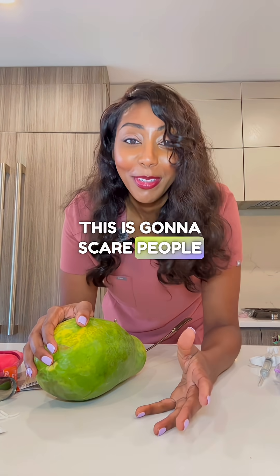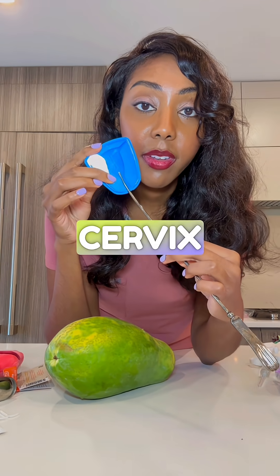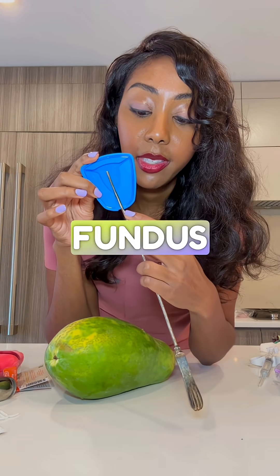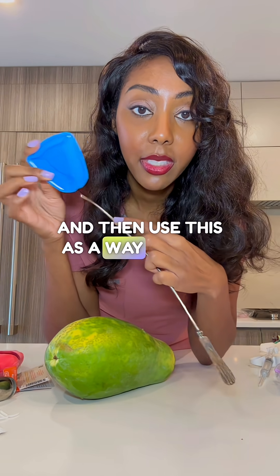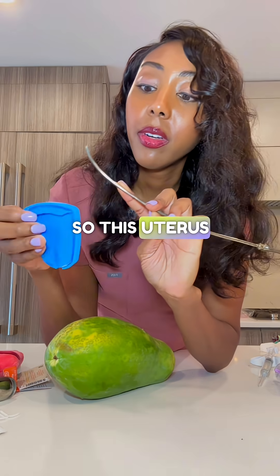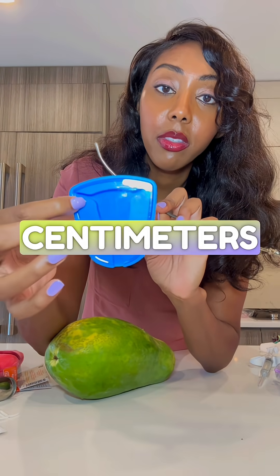This is going to scare people — don't be afraid. The provider will put the sound through the cervix to the top of the uterus, which we call the fundus, and then use this as a way to help measure the cavity. So this uterus is about five centimeters long.